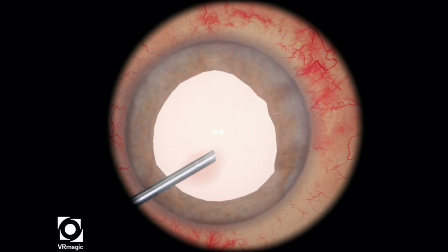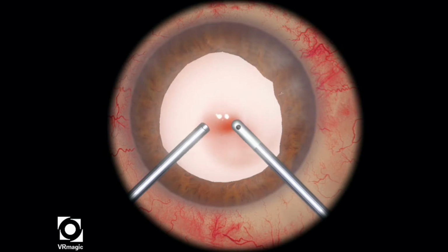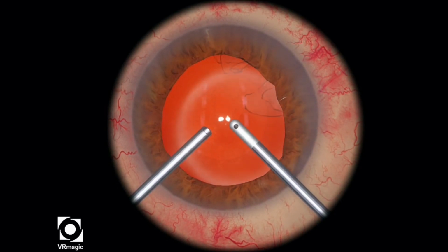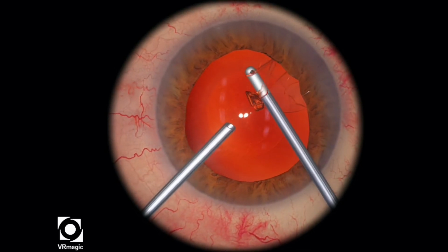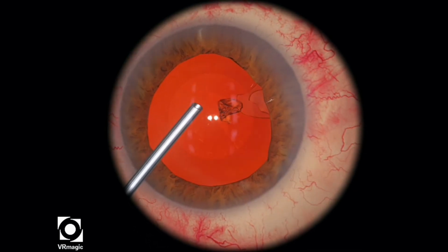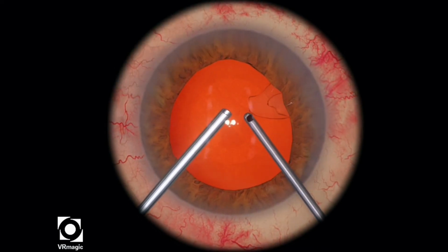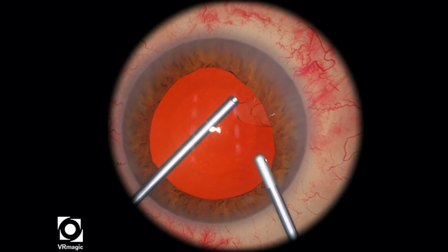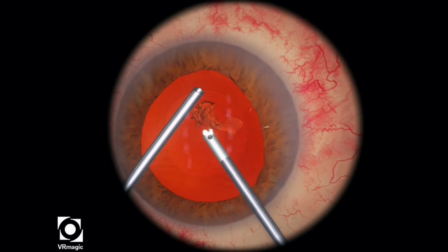But the simulator has an added problem where if you put the vitrector close to the irrigation handpiece, sometimes the machine just glitches out and then it says that you're touching the cornea. So I've had to deal with that as well, messing up my total score, which I wasn't very happy about. However, you do have to still persist, and we were able to capture this particular video where I did score 100, and you just have to be as careful as possible.